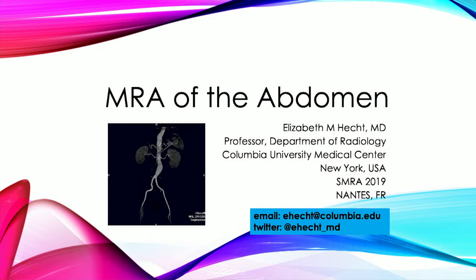Okay, hello again. My talk is on MRA of the abdomen. We've talked about the aorta. We've talked about the renal arteries. So what's left for me to talk about a little bit more are the mesenteric vessels, so I'll focus on those.